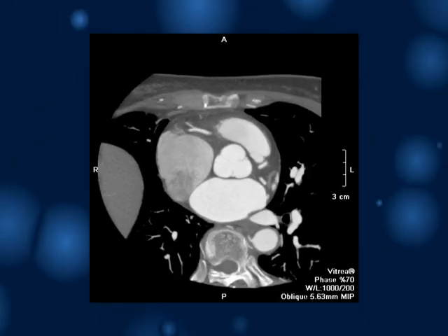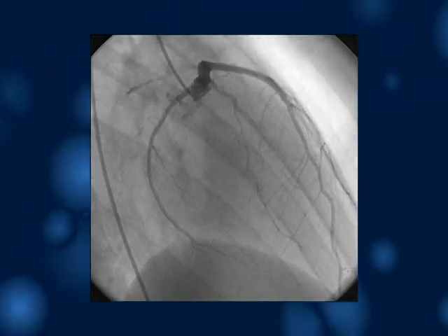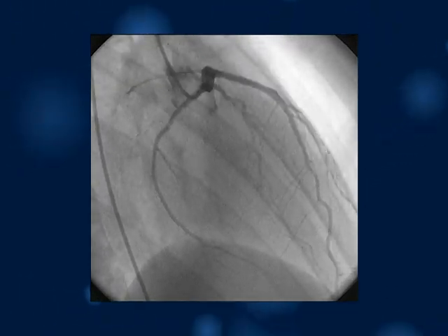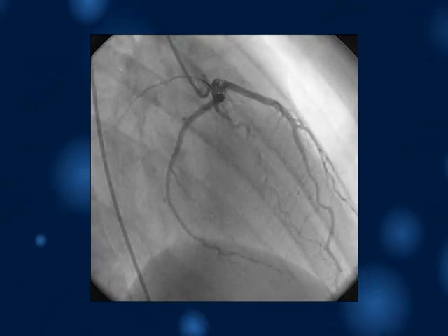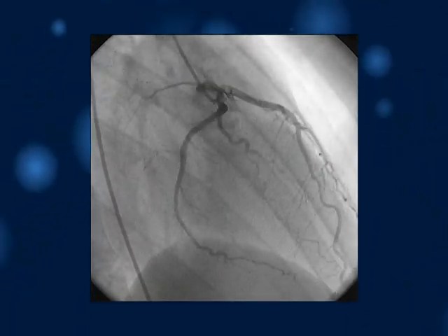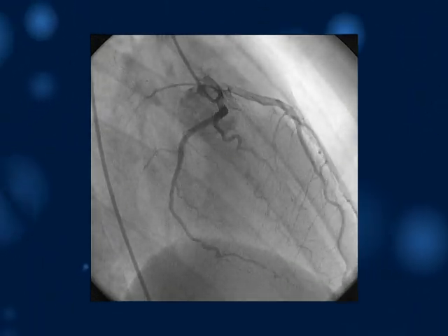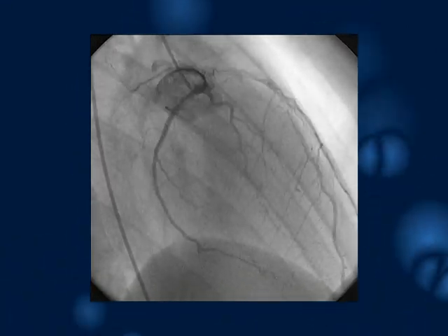The most dangerous and potentially lethal coronary anomaly is that of the left main coronary artery arising from the right sinus of Valsalva and traversing between the aorta and the pulmonary artery. In this example, in a young individual, the left main coronary artery runs from the right upward, forming an anterior dot in front of the aorta and moves forward down the LV.